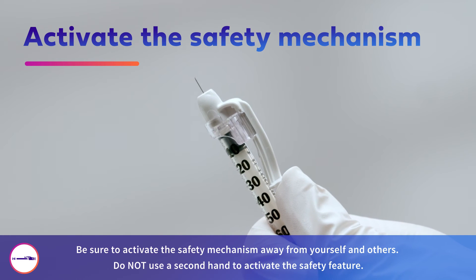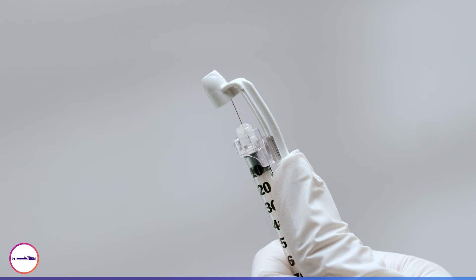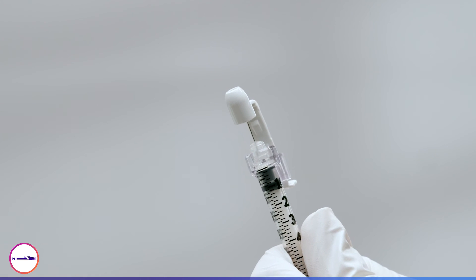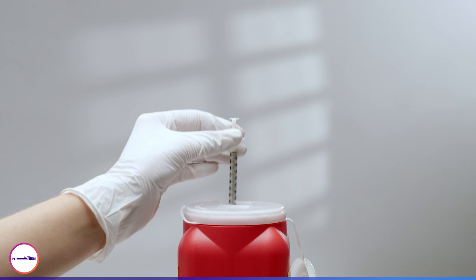After the injection is complete, immediately activate the safety mechanism by using a simple one-handed technique. Move the safety arm completely forward until it is fully extended and the needle tip is covered. You will hear a clicking sound when the safety mechanism is activated. Discard the used syringe in an approved sharps container and in accordance with applicable regulations and institutional policy.